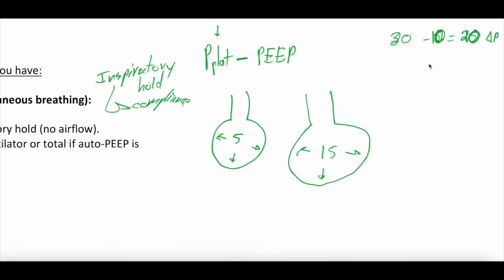And we're going to draw an alveolus if you're watching the YouTube video, and that alveolus is here, okay? And let's say we're like, goodness, is this the right amount of PEEP? Could they be under distended, under recruited, or over distended, over recruited? And I think, based on my clinical assessment, that they are under distended, right?